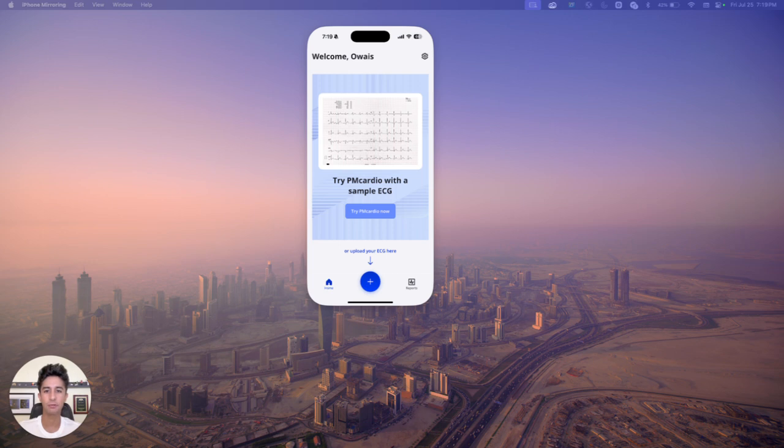The main thing that's different about something like this app is that it has machine learning or deep learning models. Essentially every time someone uses it, it's using that information to be better next time. A traditional EKG machine is not going to have that. It also has contextual understanding. When I'm playing around with this, it asks you what the presentation is, and you can put that in. It also asks you what the result is, so maybe it calls something a STEMI, and then the patient goes to a cath lab and they have clean coronaries. You can give it that feedback, and once again, it's getting better. That's how it's different.